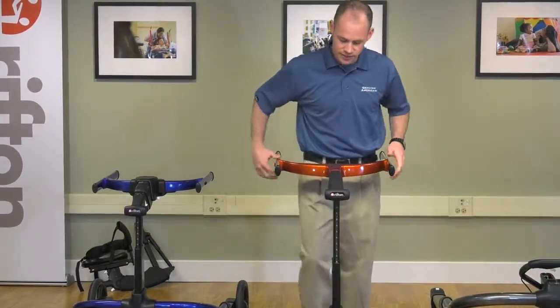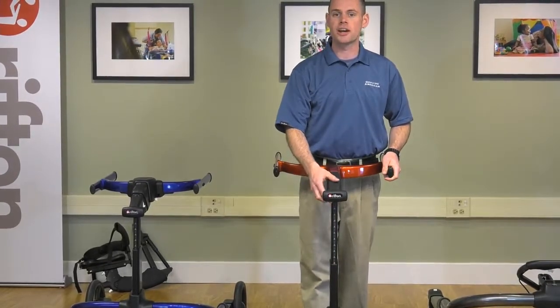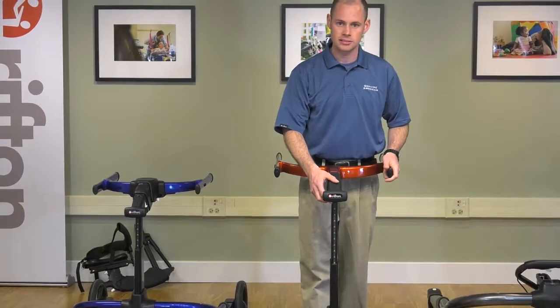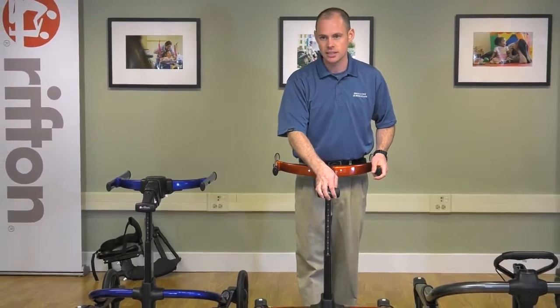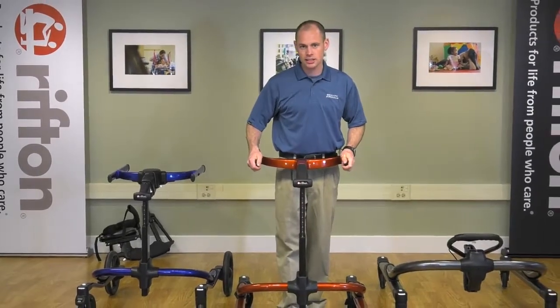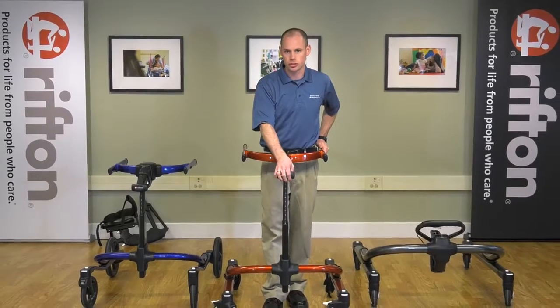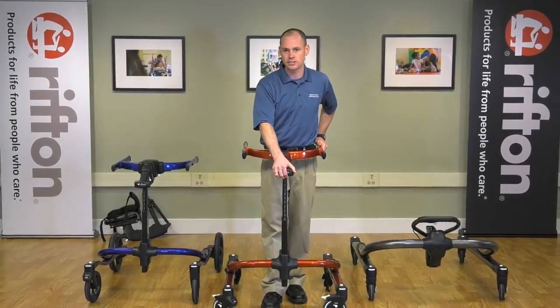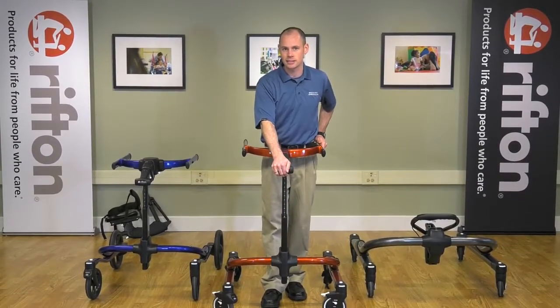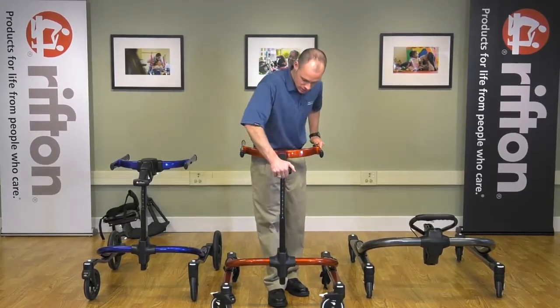You'll also notice that there are height indexing marks on the front of the column, which allow you to record the optimal height for the given client, so that adjusting the next time round for therapy, you'll be able to record the previous height and get it right the second time very quickly and easily. So that's the height adjust.